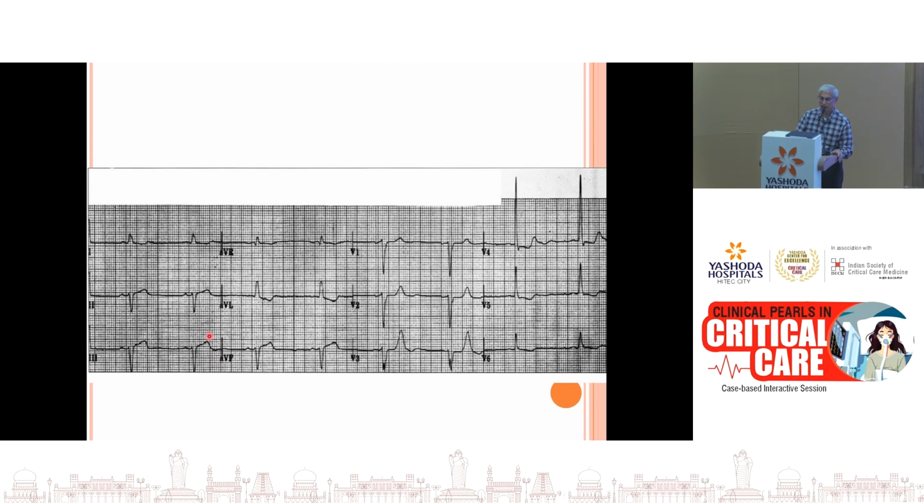There's also yet another example of inferior wall infarction, very early inferior wall infarction, especially in the presence of a left anterior hemiblock.